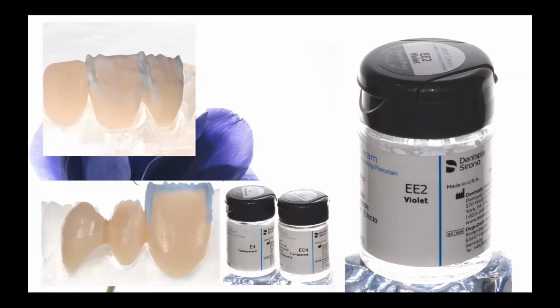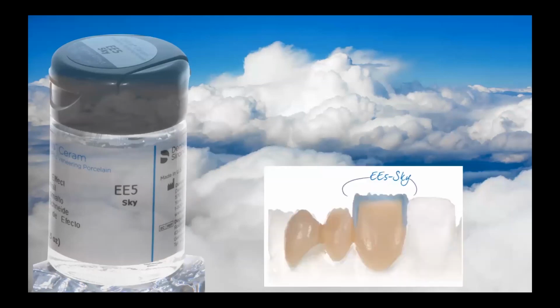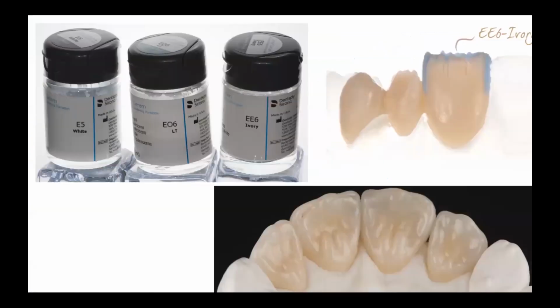Or we can make a mixture of high absorption if we mix this material with opalescent transparent, for example. And bluish opalescent enamel can be used in a similar way. In our system, its name is Sky. So we can make an enamel frame with the help of this bluish opalescent material, or add it on the whole surface. For example, when we work according to the cutback technique and we don't have enough room for the depth of our enamel layer.